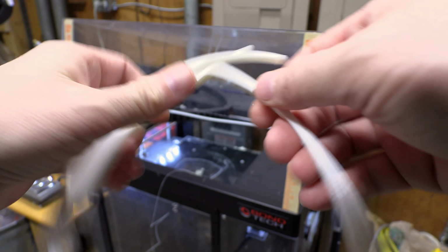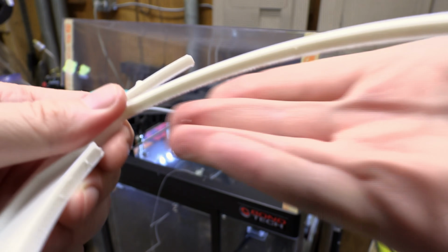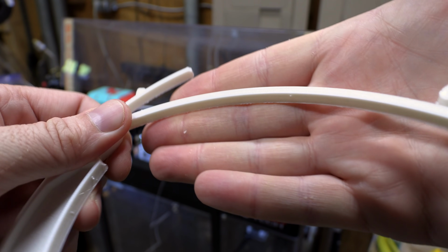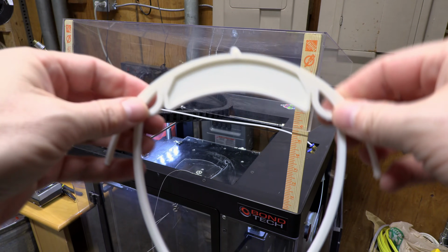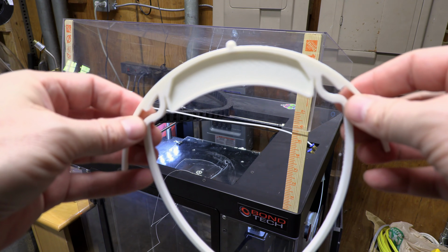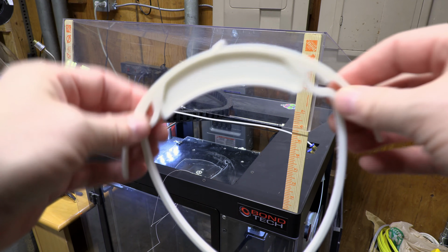I can just take a knife right along there. Oh, and let's see, I don't know if you can see that edge right there. That edge right there, a knife along there, that should clean it up just fine. Okay, so this is usable. That's great. Let's go, I don't know, what do you think? Let's go check another printer.